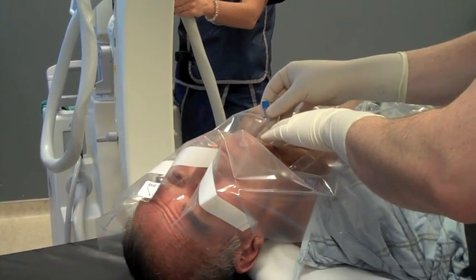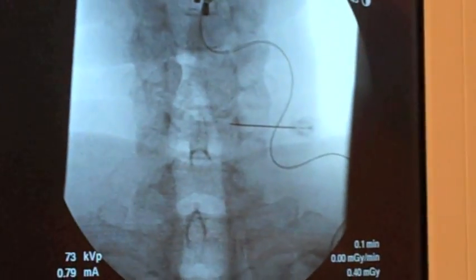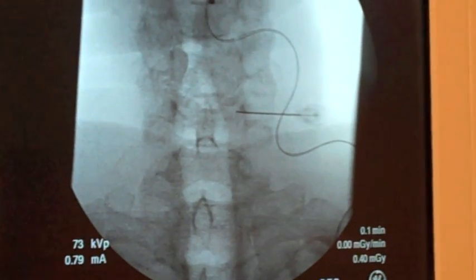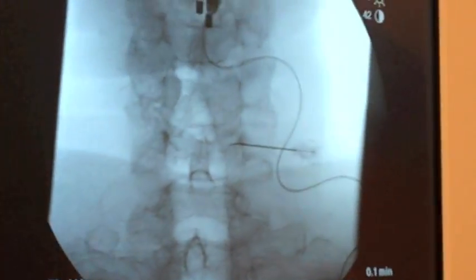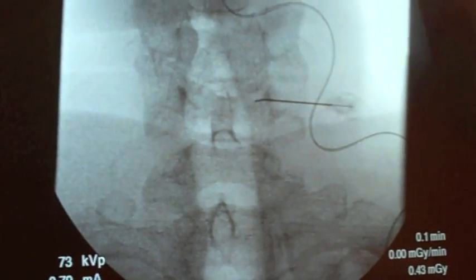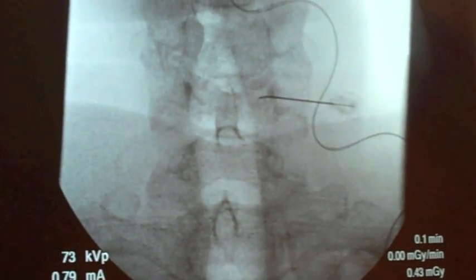We're going to go ahead and get started on this procedure. The muscles and the trachea here, and we'll look up on our x-ray here. The needle is advanced down here until bone is contacted, and it is at the anterior aspect of the vertebral body there. And what we're going to do is place a little bit of contrast dye here, and you'll be able to see that on the x-ray.